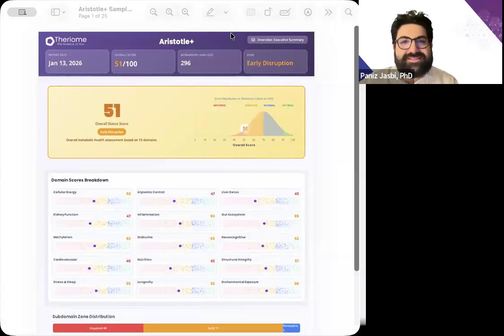Welcome to the 10-minute walkthrough of how to interpret the Aristotle Plus. The Aristotle Plus is designed to help you move from complex metabolomics to a practical clinical plan without getting lost in individual biomarkers. And in this video, I'm going to walk you through a consistent, repeatable reading and an order using this sample report here.